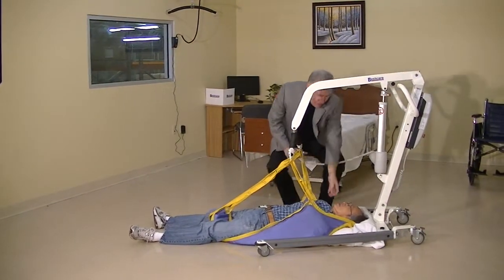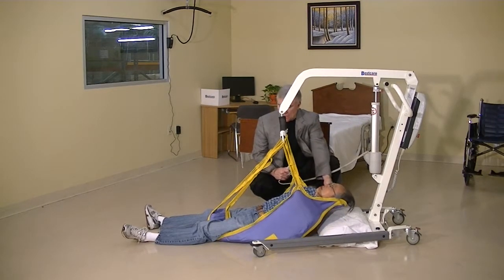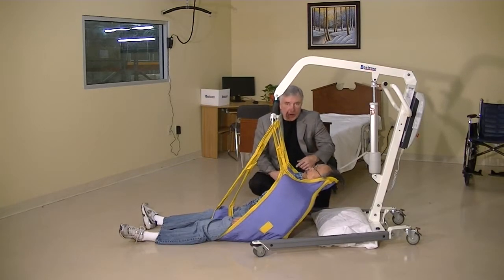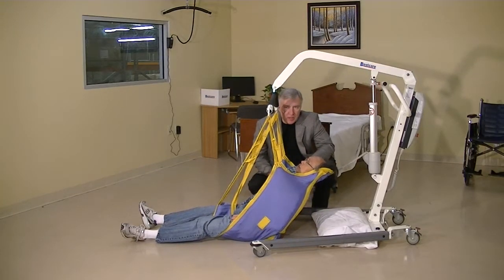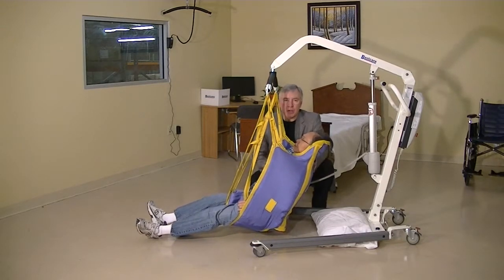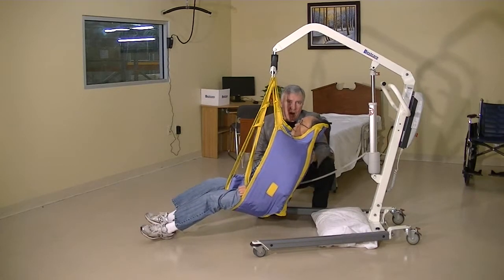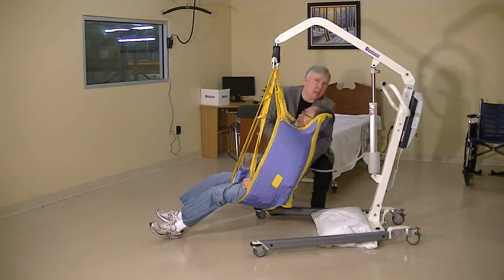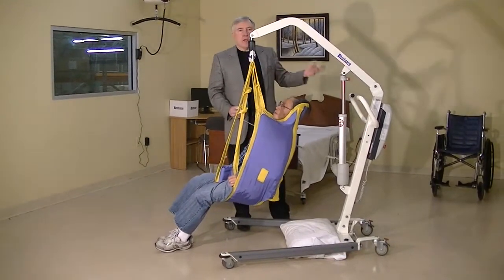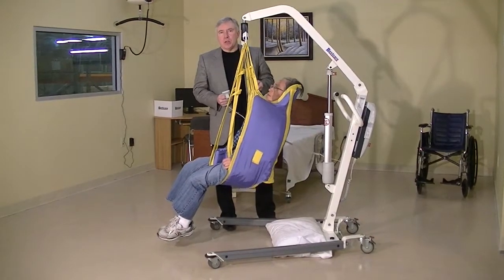While we're raising up the patient, we just want to pay attention to them down here and make sure that they're comfortable. You can see that the natural movement of the sling, even on the furthest loops, is to start raising up the person's shoulders first and then start lifting up the legs — so it keeps them in a seated position while raising them up off the ground. From here, we can transfer the patient to the wheelchair or to the bed, and we have our floor transfer accomplished.